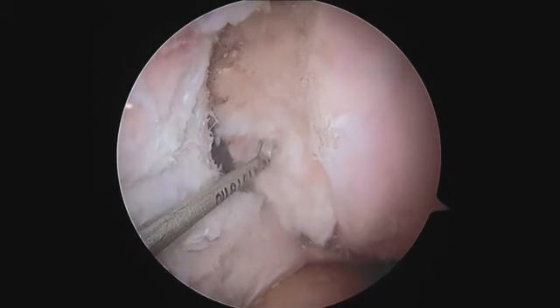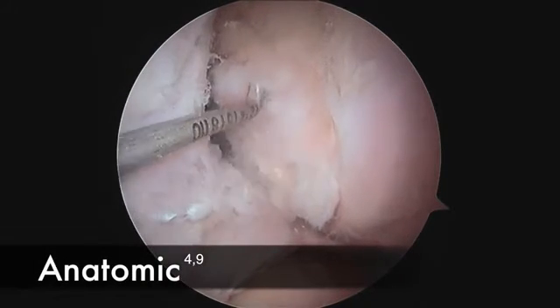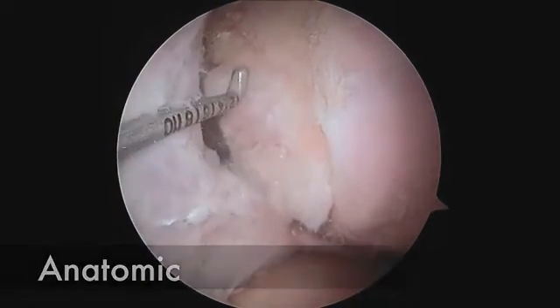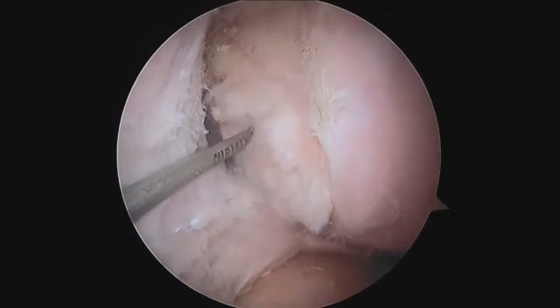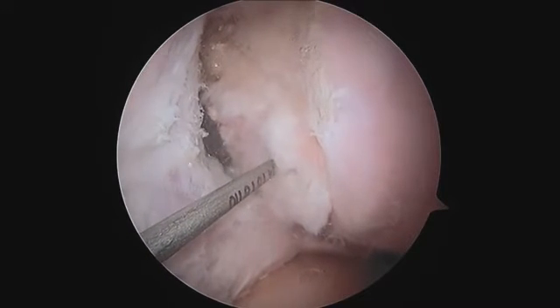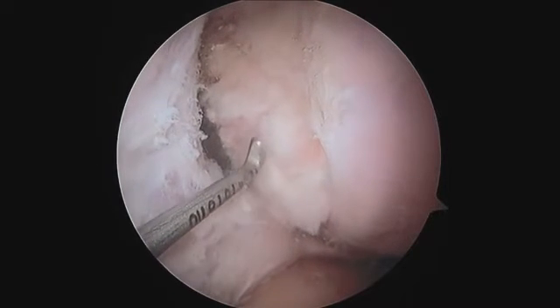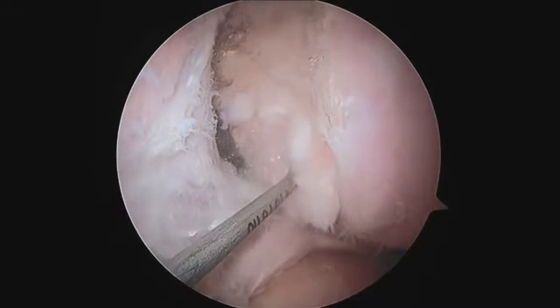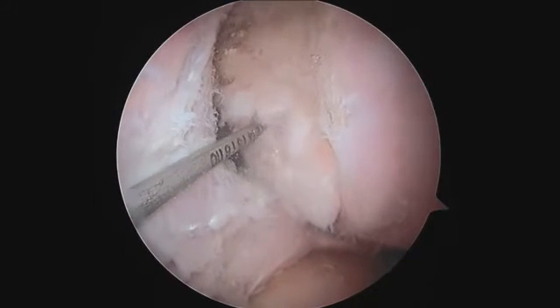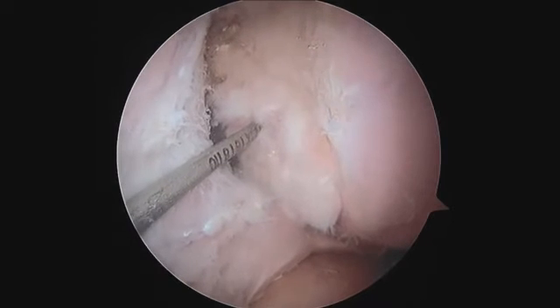The A in the ideal acronym stands for anatomic. So this is the entire ACL femoral footprint. You can place a tunnel in this region and be anatomic, in this region and anatomic, or in this region and be anatomic. The point is that the footprint is so broad that there are many anatomic locations within the footprint. We choose an anatomic location, i.e. a location within the footprint, but one that's eccentric within the footprint. It's not dead center in the middle of the footprint.